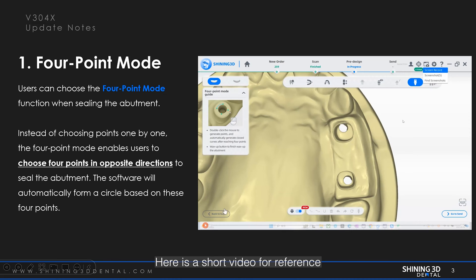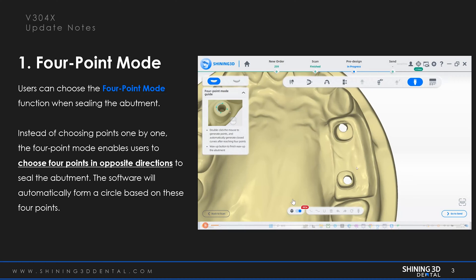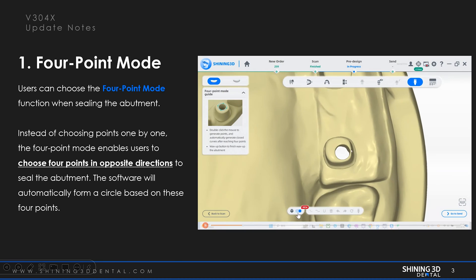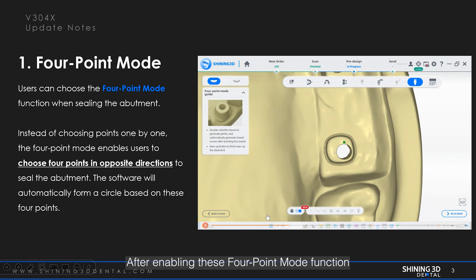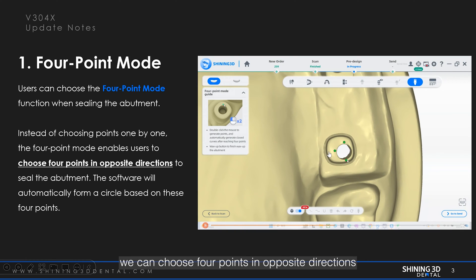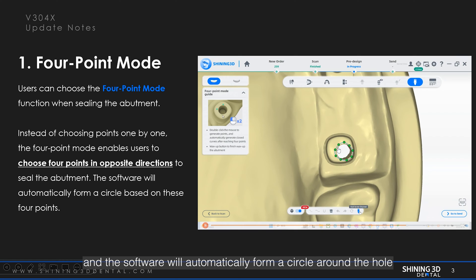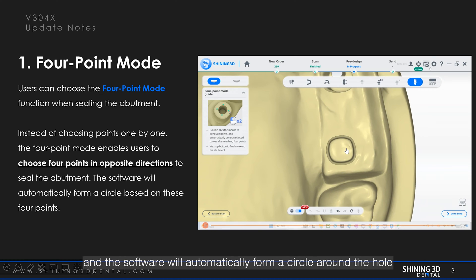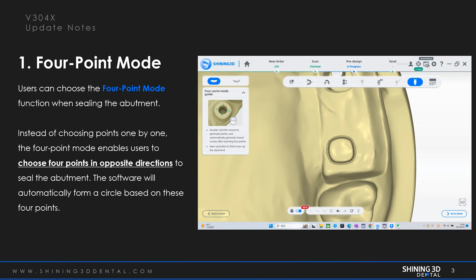Here is a short video for reference. After enabling the four-point mode function, we can choose four points in opposite directions and the software will automatically form a circle around the hole. And that's how it's done.